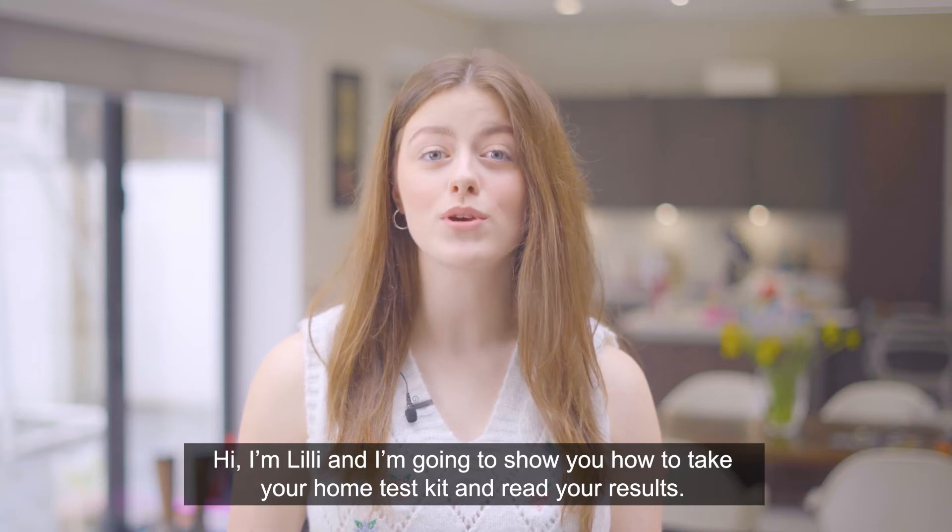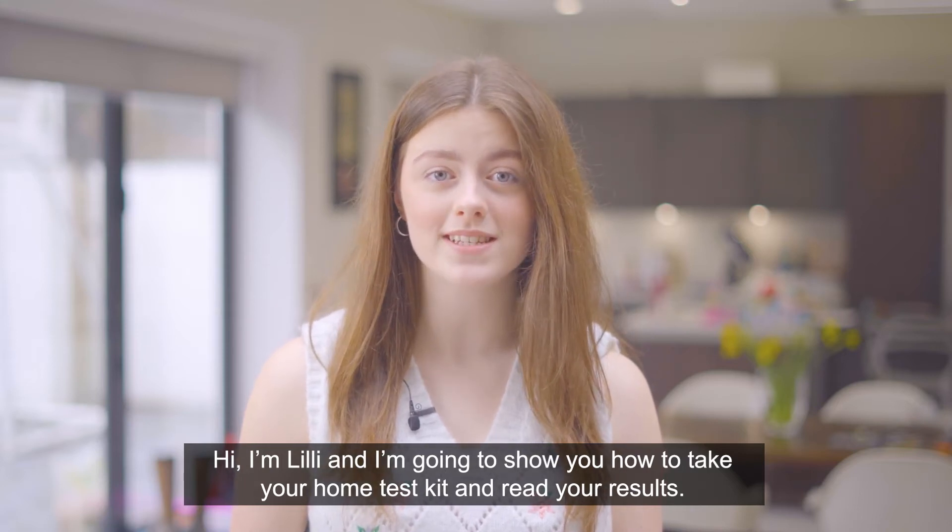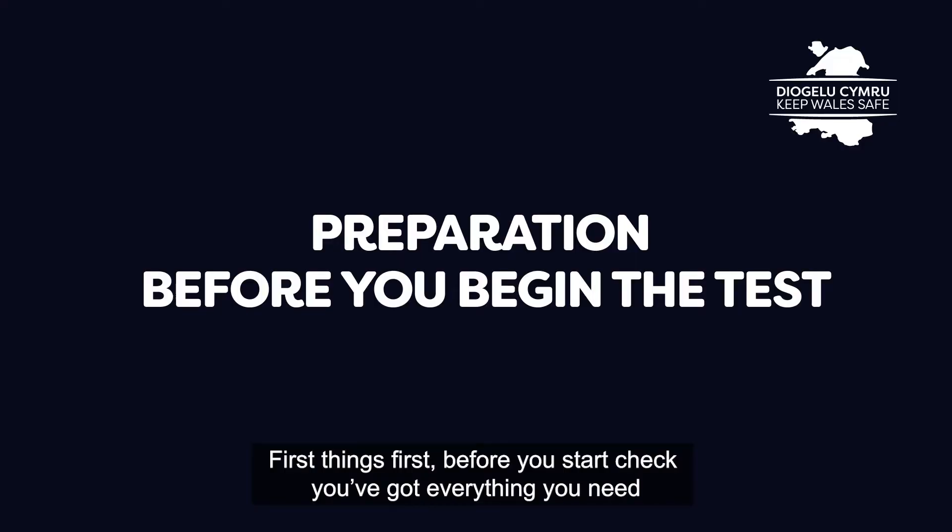Hi, I'm Lily and I'm going to show you how to take your home test kit and read your results. First things first, before you start, check you've got everything you need.